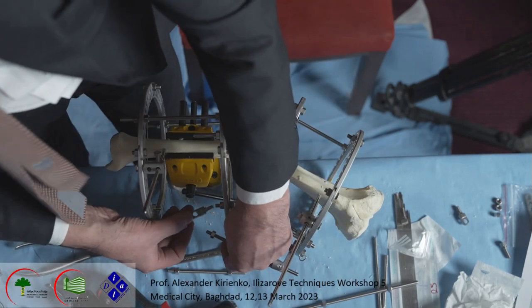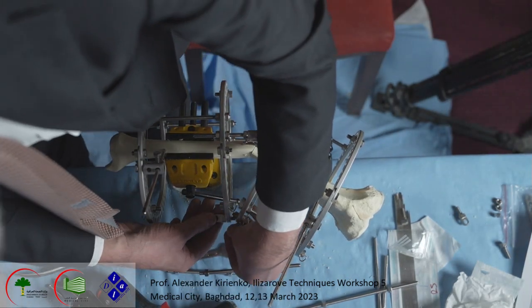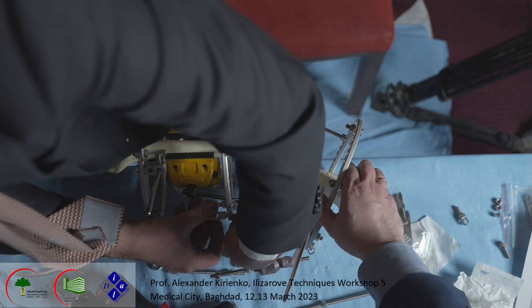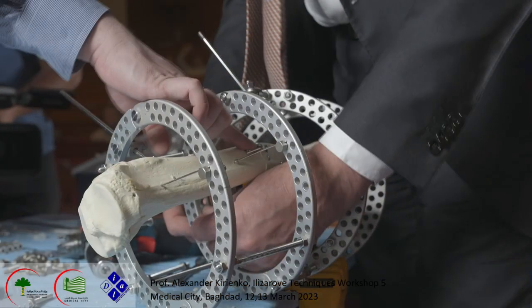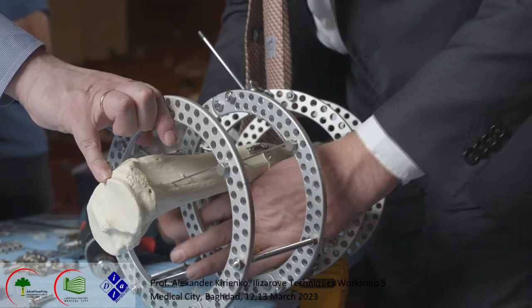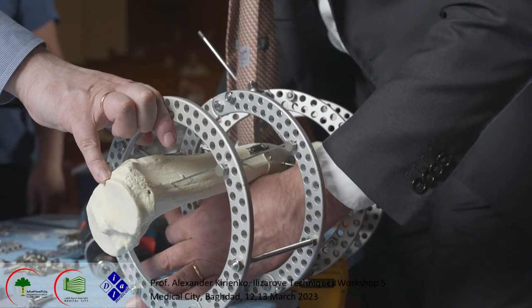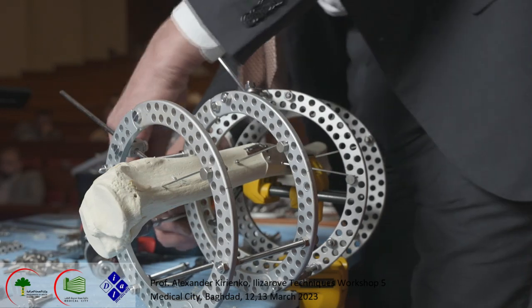Here, what I may do, for example, I put like this here. Or where I can put it. Okay, like this.